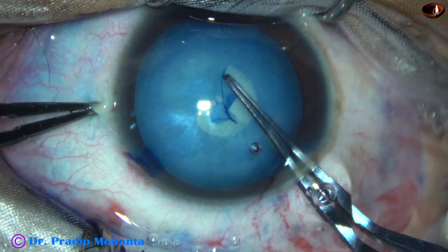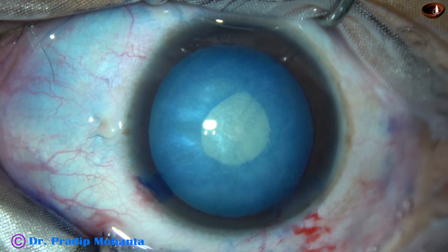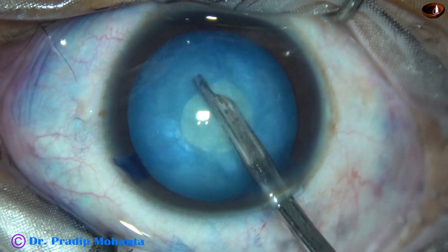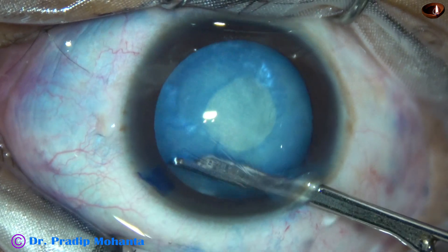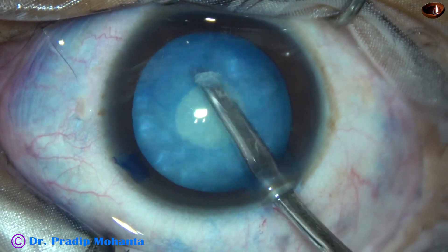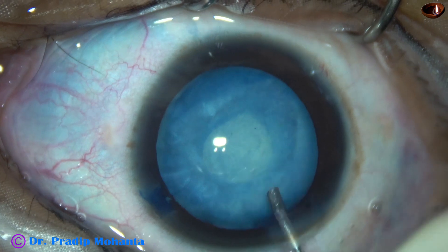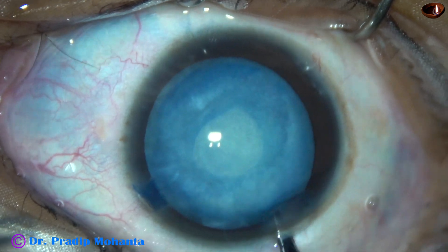Now, since this is an intumescent cataract — actually a pre-intumescent cataract — there is convexity of the anterior capsule of the cataractous lens. I decompressed the capsular bag by aspirating some cortical lens matter. And then visco was injected into the anterior chamber, after which the small rhexis is enlarged.